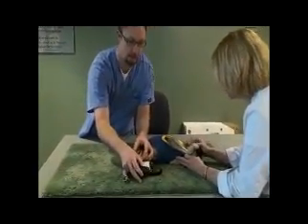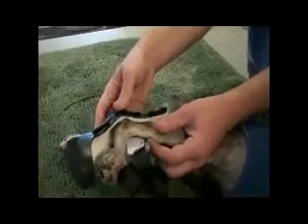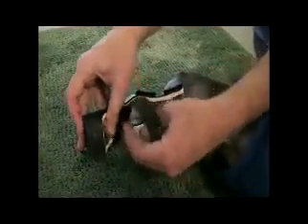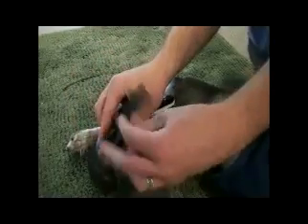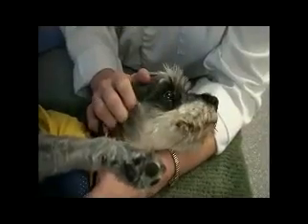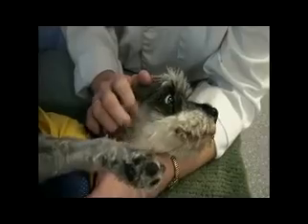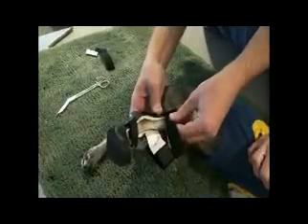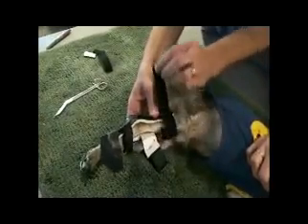He could get around on 3 legs, essentially, if he had to, but he doesn't want to, and he has a viable leg here, and Orthopets has created a device that's going to allow him to walk normally. So in Kermit's case, with his injury, he wants to use his back leg, and he is always trying and testing the ground. His brace will allow him to use his leg as normally as possible. Now, we usually see in these cases that the brace controls the rest of the leg.